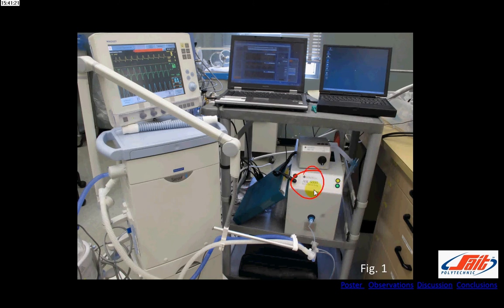So here's the ASL 5000 and the computer that I used, just a laptop computer that gives us the information and controls the ASL 5000. So we actually build the test lung simulation on the computer, and that's driven right here by the ASL 5000. Now what you can't see is in behind here there's a little cylinder that moves in and out, replicating either spontaneous breathing by the patient or a standard lung simulation just like we have now. So I hooked that up to a Servo-I ventilator using a normal neonatal circuit, and I used a 3.5 neonatal endotracheal tube to ventilate the ASL test lung. So that's the basic setup.